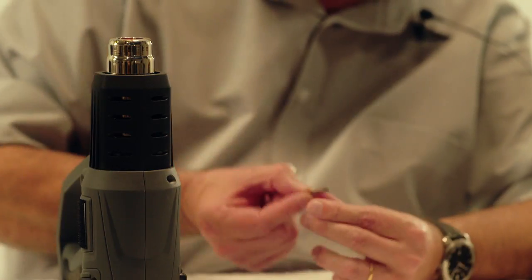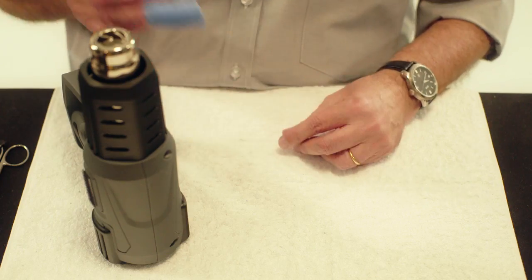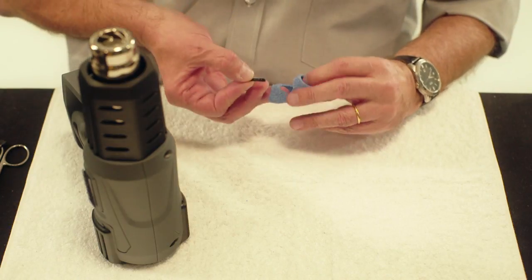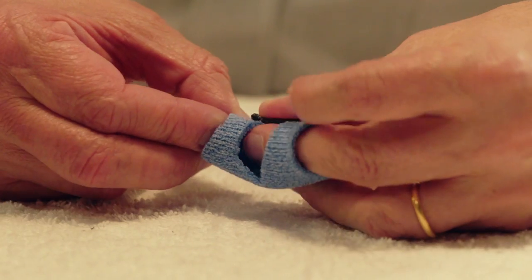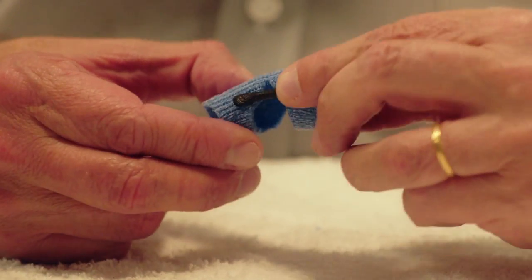Heat both sides of the multicentric hinge. Heat the side of the orthosis where you'll stick the hinge and stick them both together. Repeat the same for the other side.